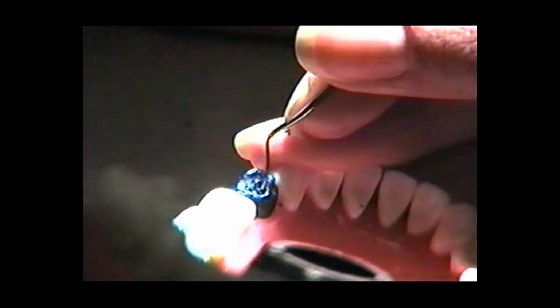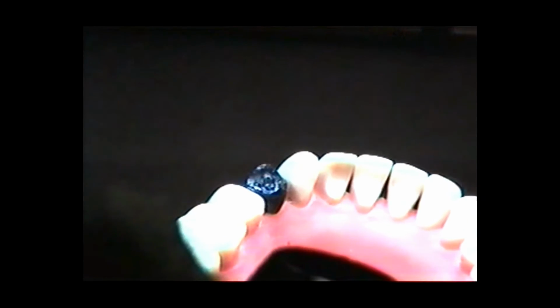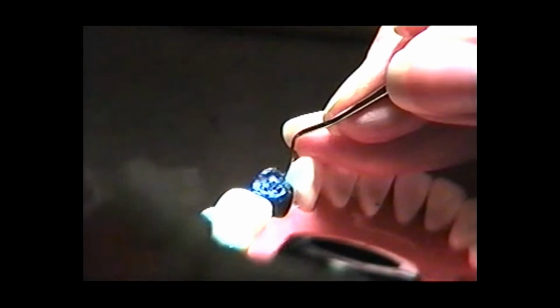Remember, this is a guide for you. As you're doing your central groove and you don't know how deeply to carve it, they're all at about the same level. So I'm going to look at the adjacent tooth and say, okay, my central groove's a lot higher up on the tooth. I'm going to carve it a little more deeply.